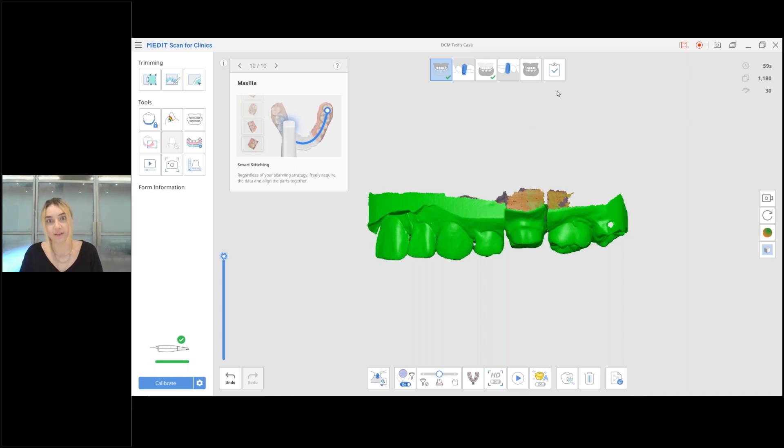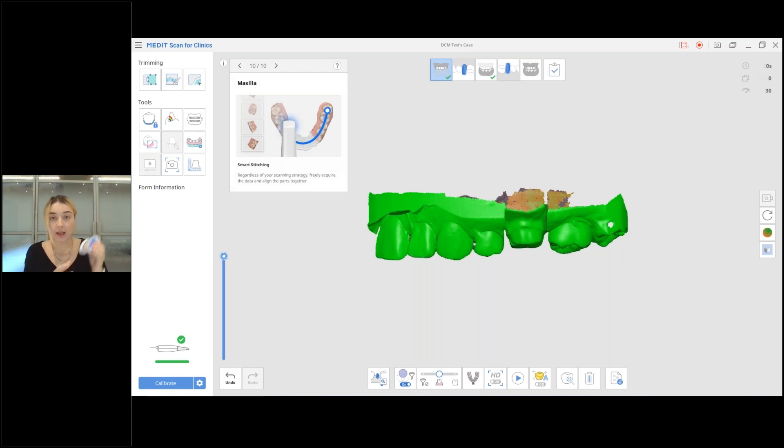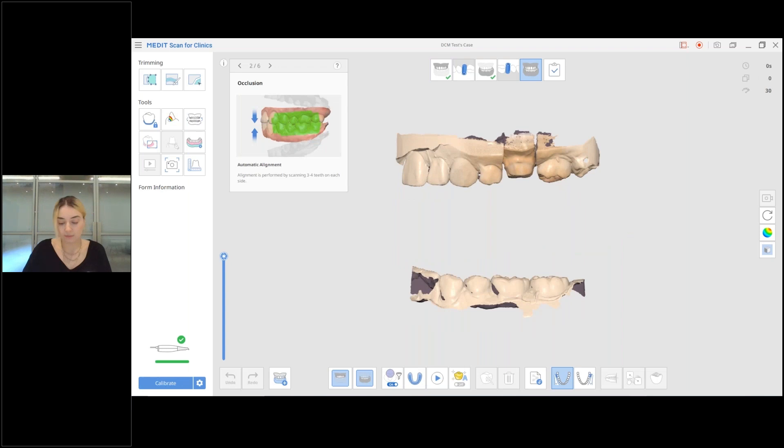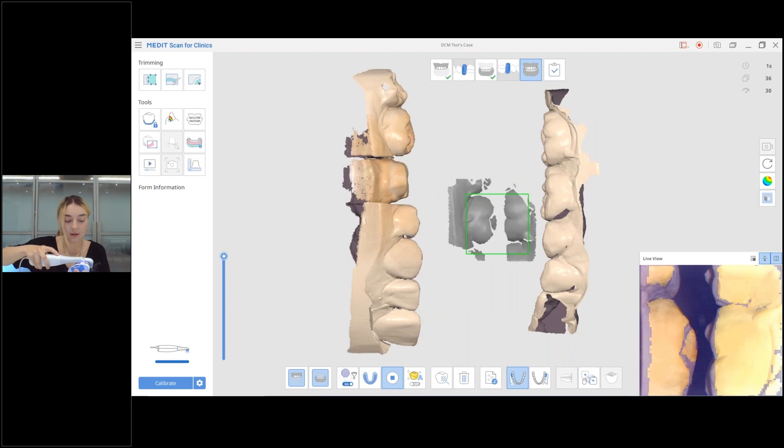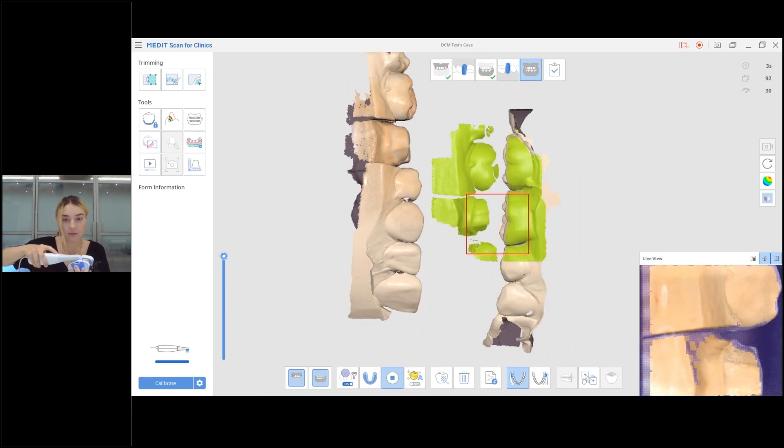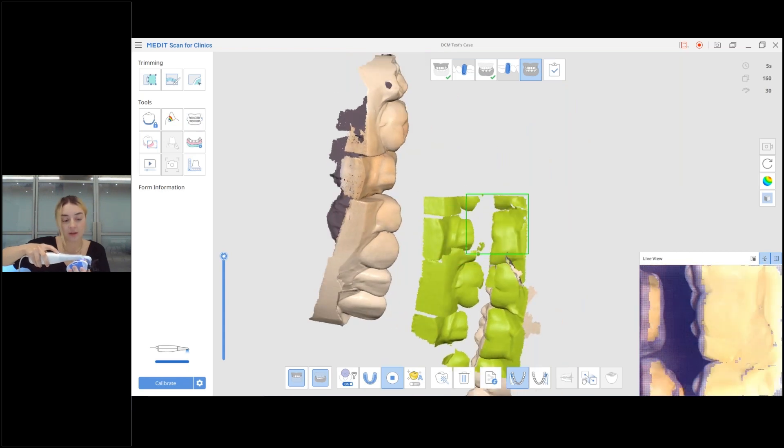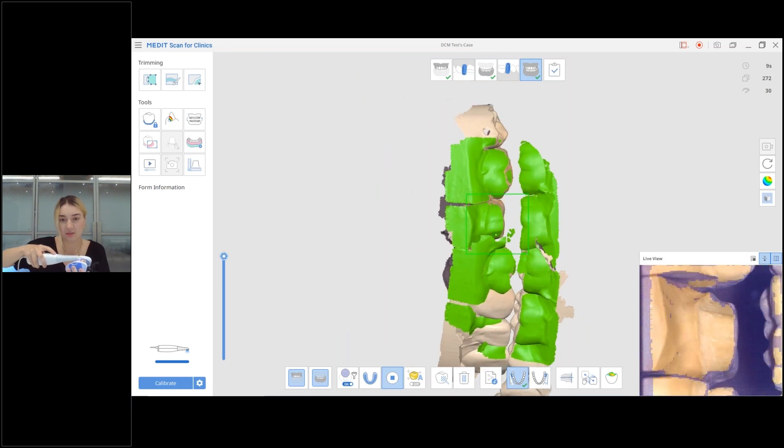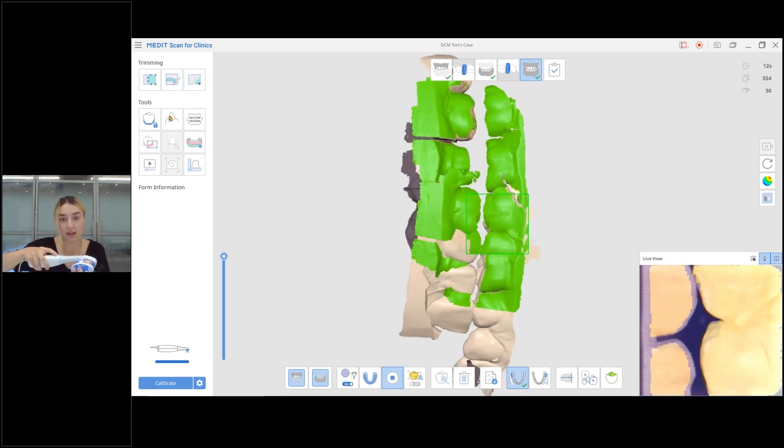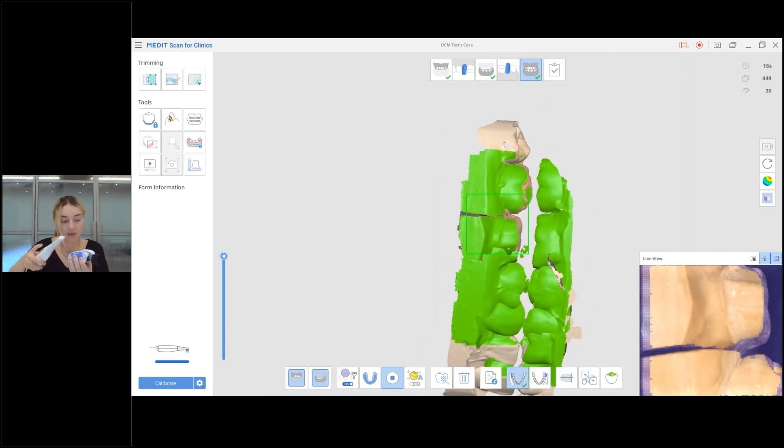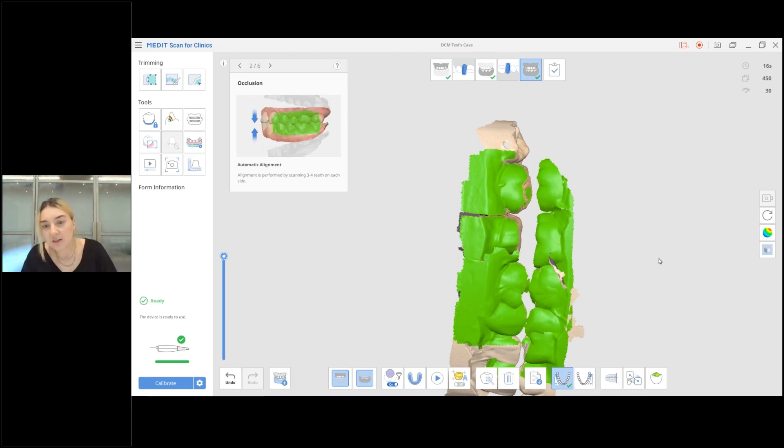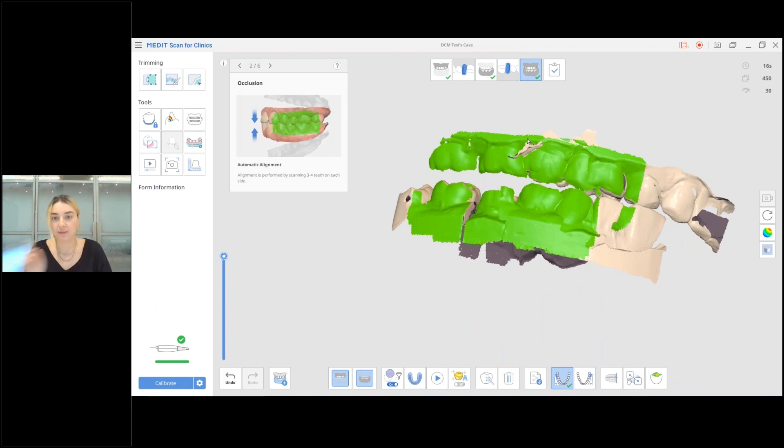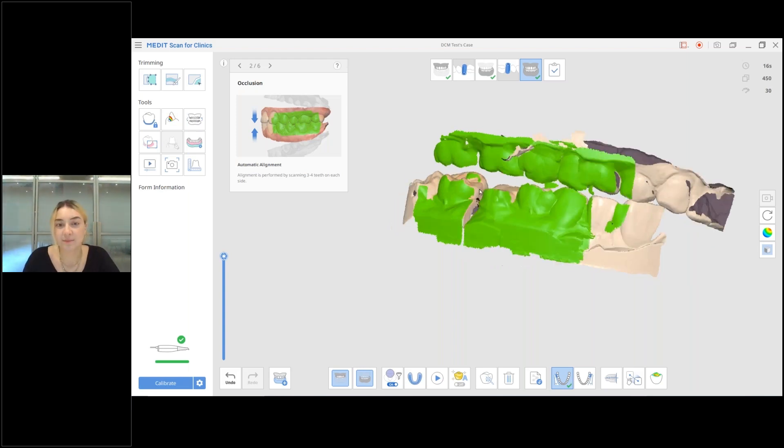And now just as I said before, we're going to scan the occlusion. I'm going to the occlusion stage and I'm just going to scan. As usual, if you have any trouble scanning the occlusion, if it takes some time to align, don't hesitate to just use manual alignment. It's nothing wrong with it, it's totally fine. Here it took me about five, around five teeth to get my occlusion, but we do recommend scanning four teeth on each jaw, even if it becomes green even faster.